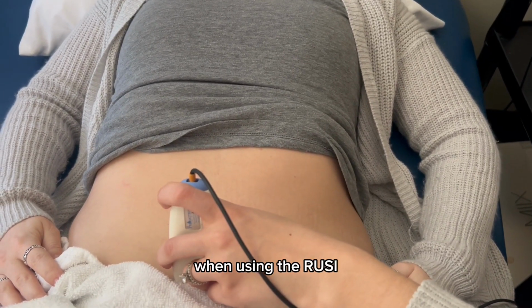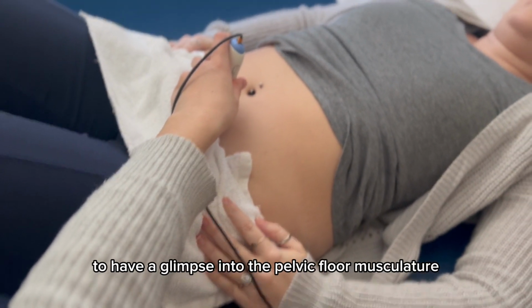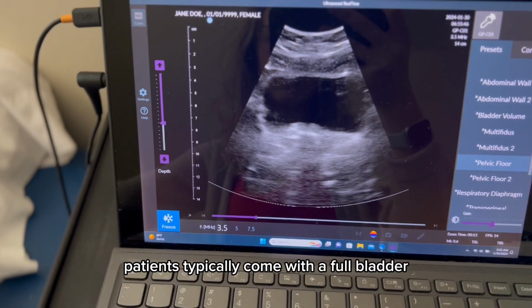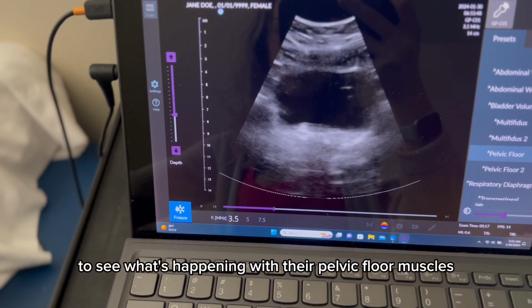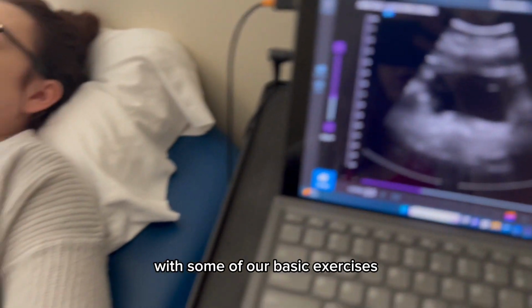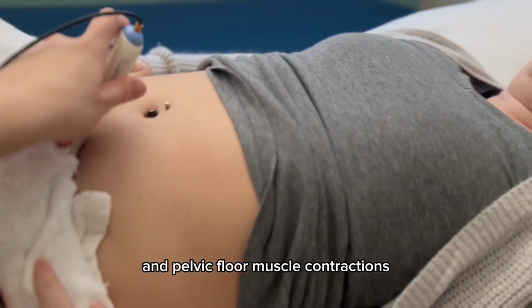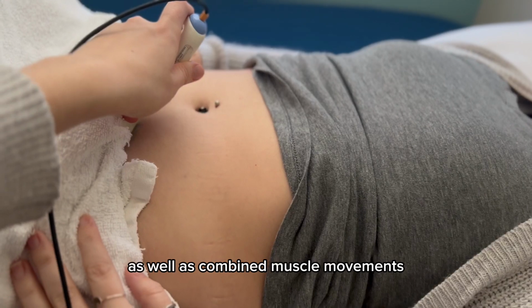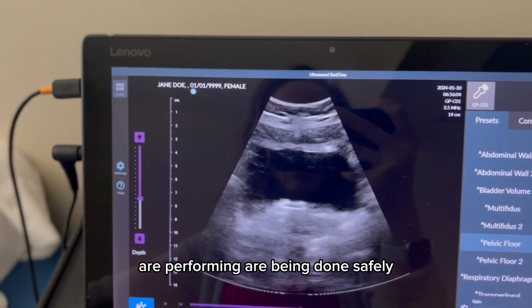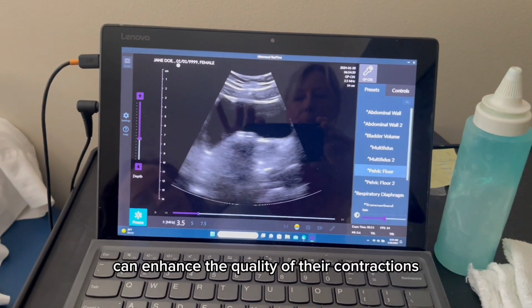When using the RUSI, we place the transducer head suprapubically to have a glimpse into the pelvic floor musculature. Patients typically come with a full bladder, so we can use that as a landmark to see what's happening with their pelvic floor muscles with some of our basic exercises like diaphragmatic breathing, transverse abdominis contractions, and pelvic floor muscle contractions, as well as combined muscle movements so that we can ensure the exercises patients are performing are being done safely and so that we can provide visual feedback so that they can enhance the quality of their contractions.